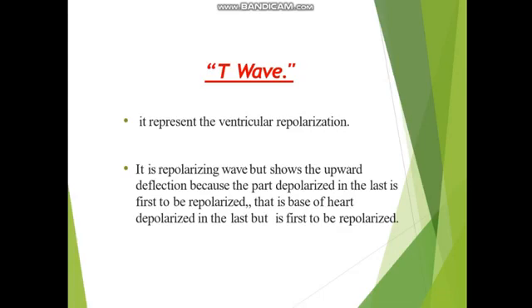This is the biggest thing for the students to remember, that it should be inverted, but it is upright. Why? It is the repolarizing wave but shows the upward deflection because the part depolarized last is first to be repolarized. That is the base of the heart depolarized last but first to be repolarized.